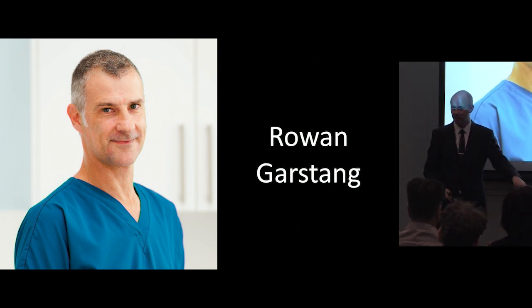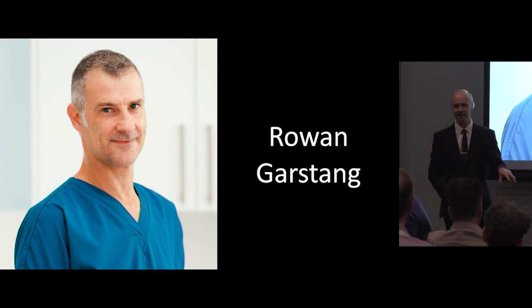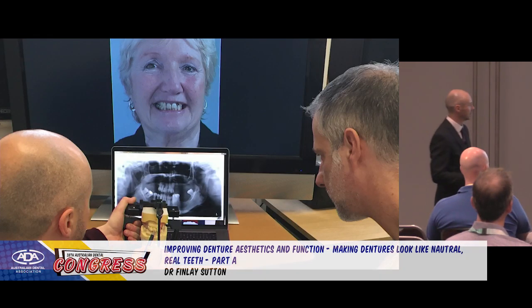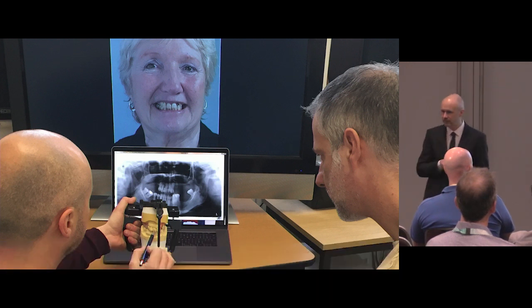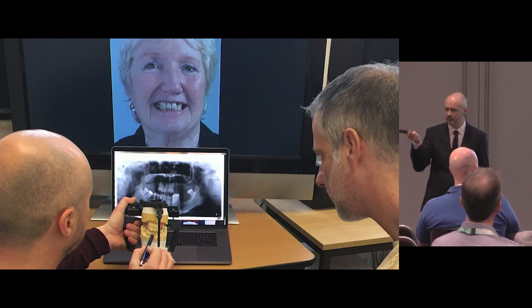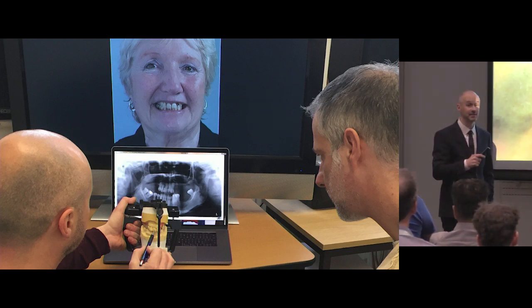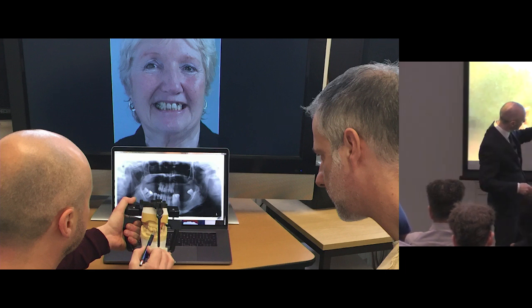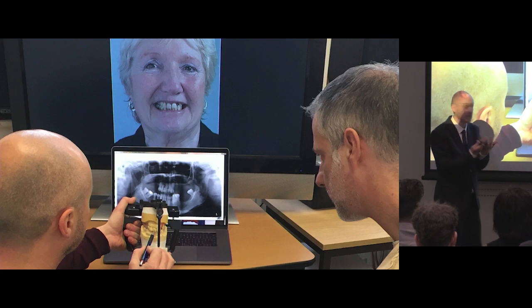Rowan works literally through a door from my clinic, the surgery, is the lab. And I regard that as the heart of the practice, and actually the most exciting part of the practice. I love it. I'm really fortunate having a lab there. It's great, talking technical with Rowan. And this is one of the most exciting parts, when we have a new patient and we've taken all of the records, and we've got an x-ray, we've got all the photos, we've got the models, and we sit down and we just talk it through. Rowan has really great ideas about this. He'll say, we need to lift the occlusal plane up here or do this and that. So it's a total dialogue in terms of, can we do this? Can I achieve this clinically? It's great.